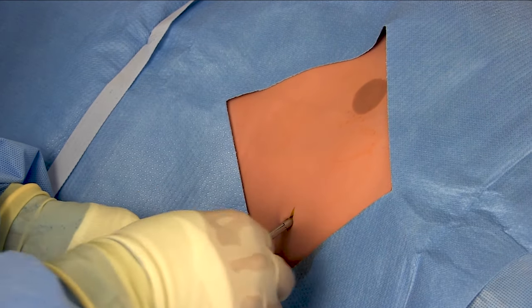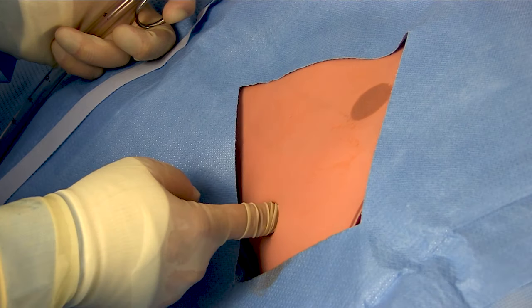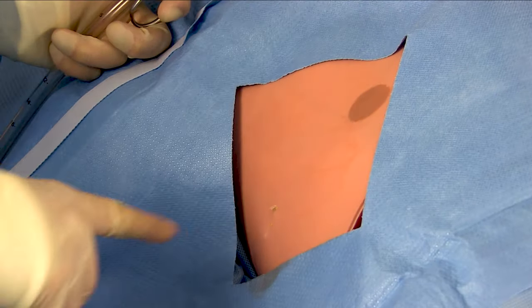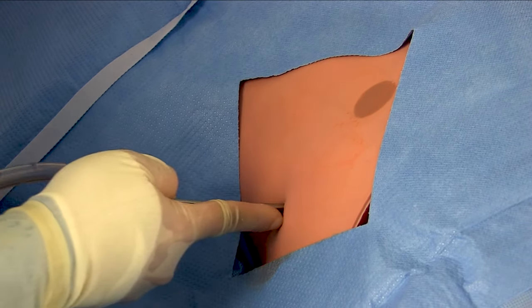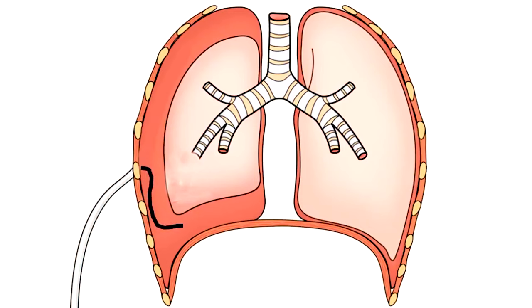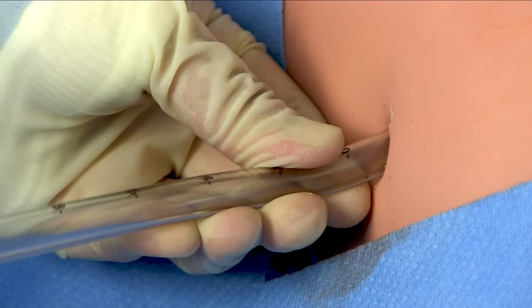Back up the Kellys so just the tips are in the hole, then give a generous spread as you withdraw to dilate the tract. Put your finger through that tract and follow it all the way down to the pleural cavity — if you're not in the cavity, you know you didn't make it through the pleura. Sweep the underside of the chest wall 360 degrees to make sure the lung isn't stuck against it. Now take a pair of Kellys and clamp the end of the chest tube through the last hole, with the clamps roughly parallel to the tube. Use those clamps to guide the chest tube through the tract over the rib, directing it either apically toward the head for draining air, or basally for draining fluid. Advance the chest tube until that last drainage hole is fully inside the body, then advance another three to four centimeters for good measure so the tube doesn't slip out later.